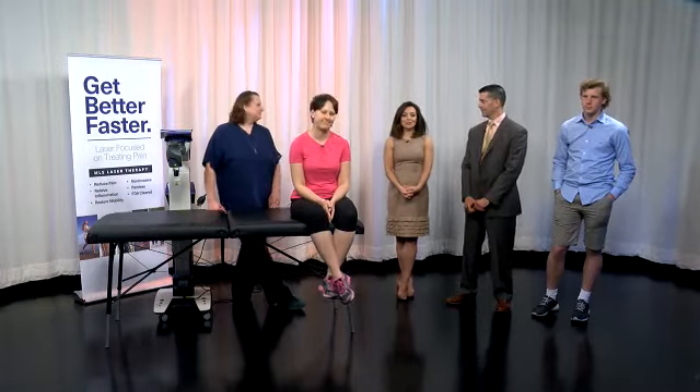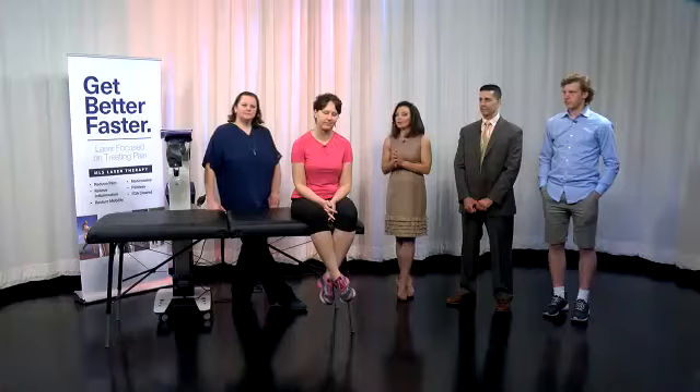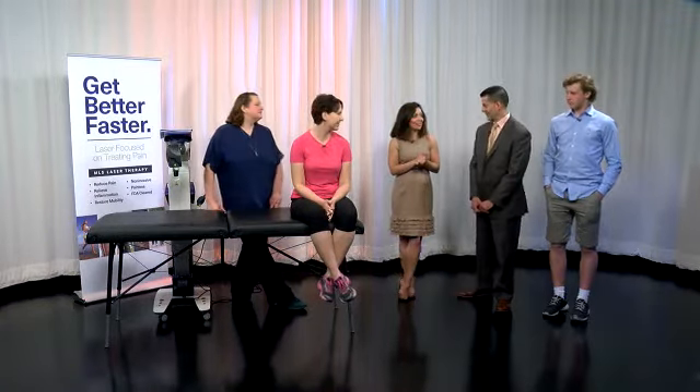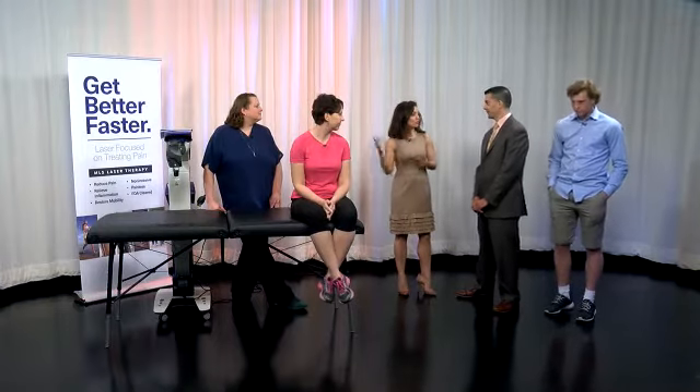Hello to our new Channel 9 Facebook viewers. I'm joined this morning by Dr. Petra Pali of Victory Sports Medicine, as well as some of his patients and Missy, who is part of his staff at Victory Sports Medicine. So we were talking briefly this morning on Bridge Street about this MLS laser therapy process. Tell us a little bit about what MLS actually means and what you all are doing with this.